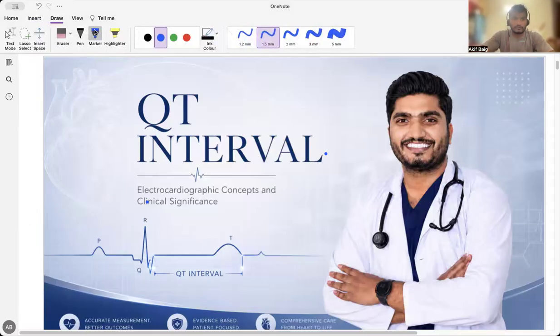Hello everyone. Today we are going to talk about QT interval and its significance in cardiology.